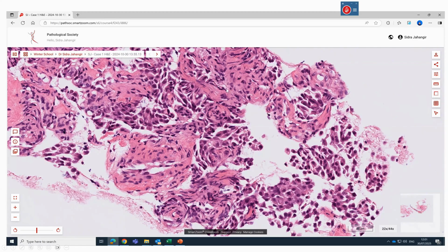But considering the monotonous lesion, there are a few differential diagnoses which should always be included in your differential diagnosis list. It could be a neuroendocrine tumor. Second is solid pseudopapillary, but then again, it's more common in female patients. Acinar cell tumor, and another important differential diagnosis is always a lymphoma, plasmacytoma, or hematological malignancies, which can present in any organ of the body.